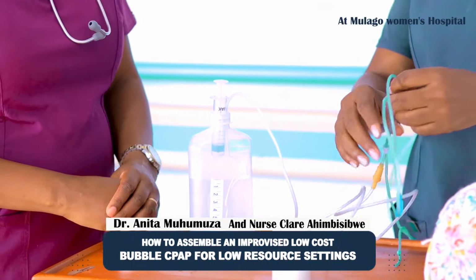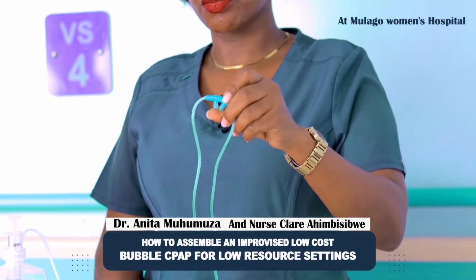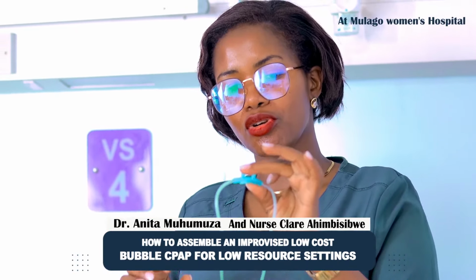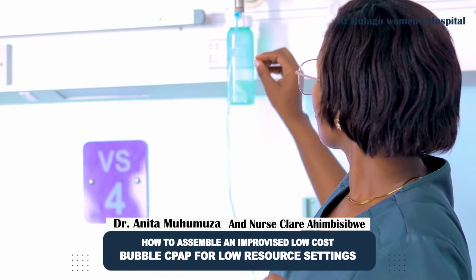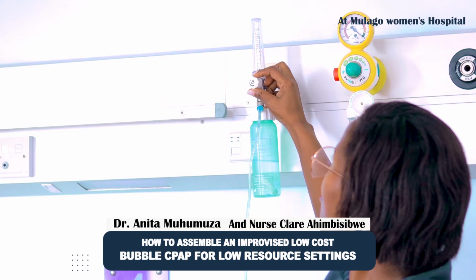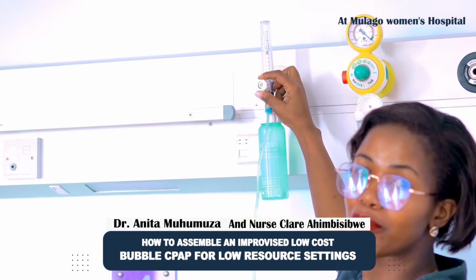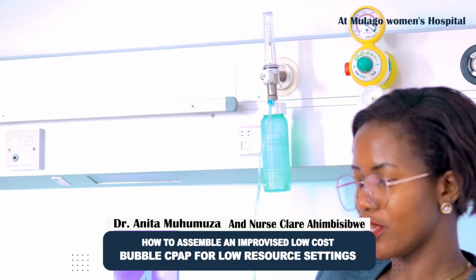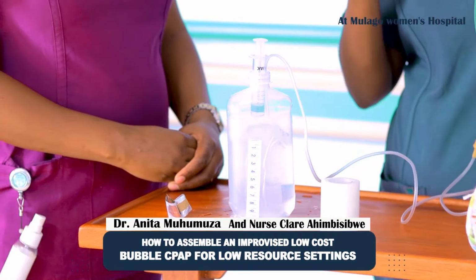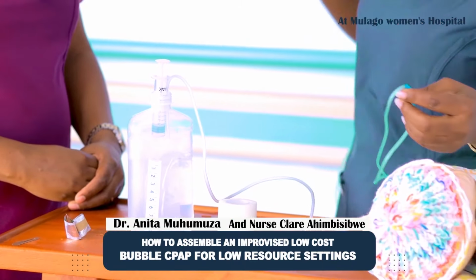So our system is complete. We are now going to first check before we connect it to the baby. So how do you check? You occlude the prongs and then you switch on your oxygen to 5 liters per minute. So we now have our bubbles, as you can see. That means our system is working. And then you connect it to the baby.